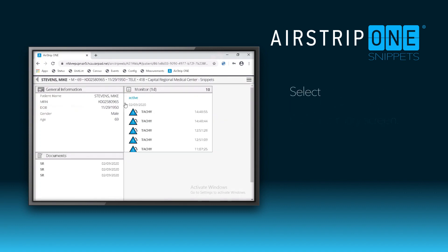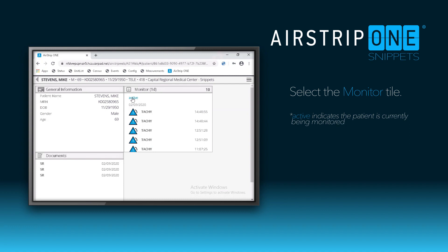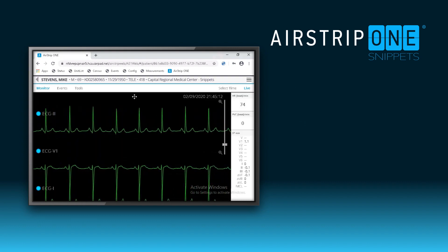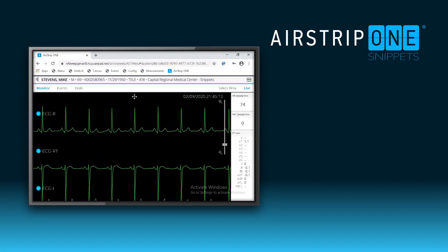Select the monitor tile, which should show an active status. Once loaded, the monitor shows the patient's active rhythm.